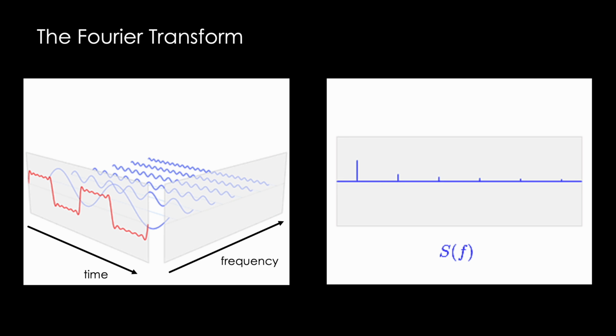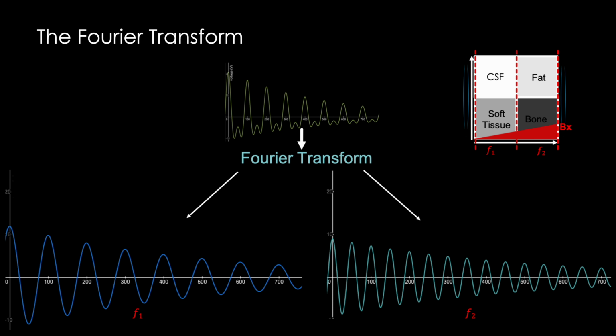function. Okay, all you MRI physics fans, where have we used this tool called a Fourier transform before? Why yes, in our signal localization lectures. This is where we took our raw MRI signal and broke it into the simple sinusoidal frequencies making up that complex raw signal.